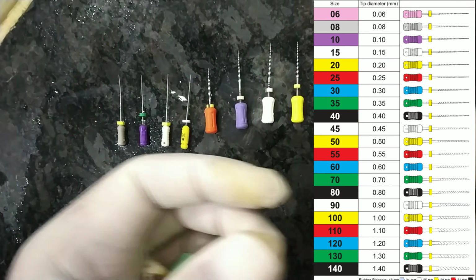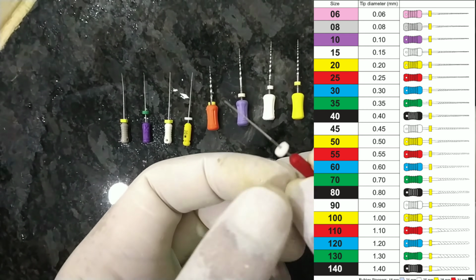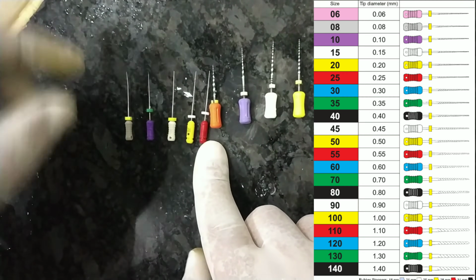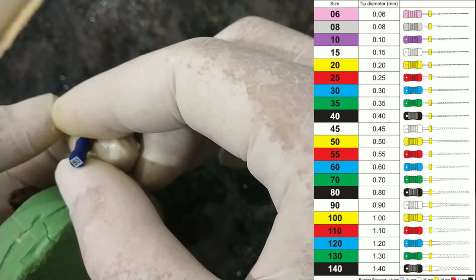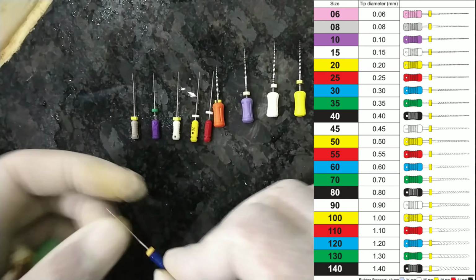Now again I use the number 25 file for filing of the tooth. So these all are 2% files. We can even use more. After this there is a 30 number file which is blue in color, as you can see here.